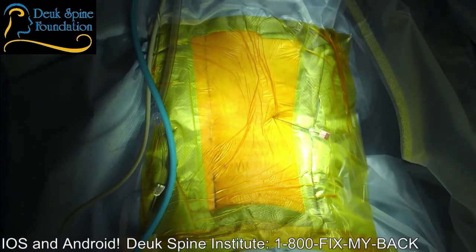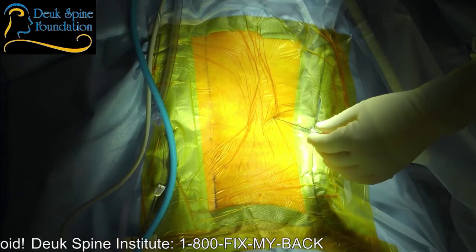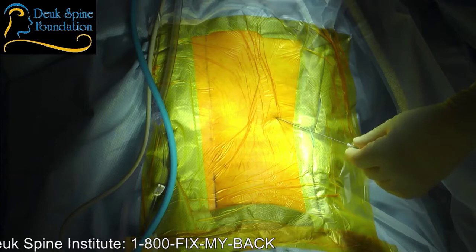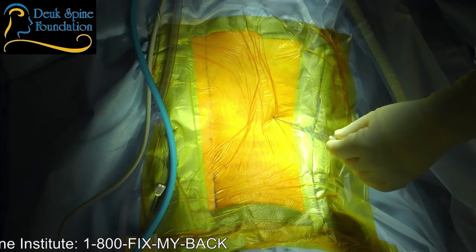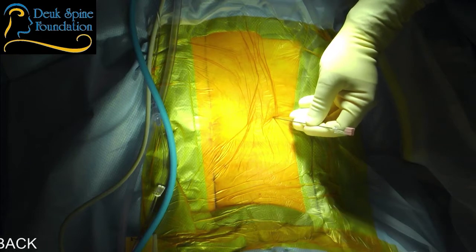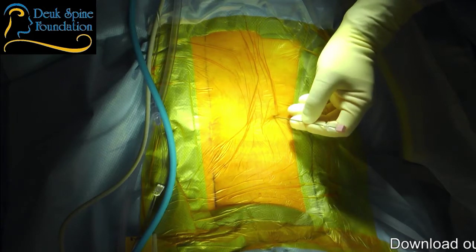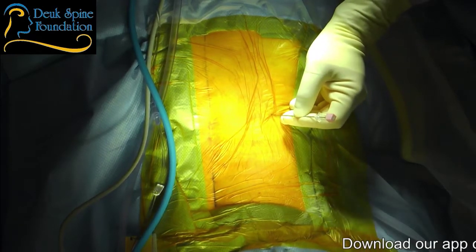All right, relax, you're okay. All the way down to the foot, huh? That's interesting. All right. Is it better? Shot. Yeah. Okay, just relax. That's why we have you awake, by the way. Shot. So you can tell me exactly that. Because we are working around your nerves.